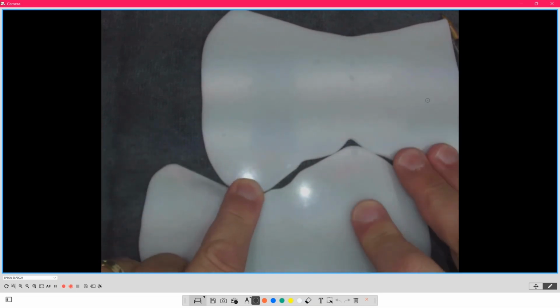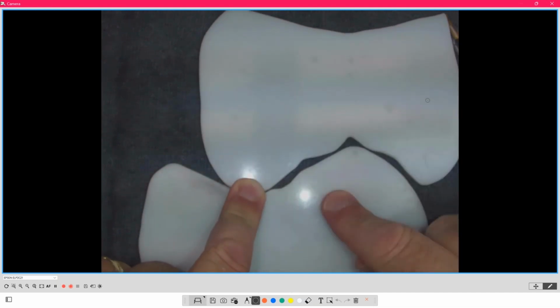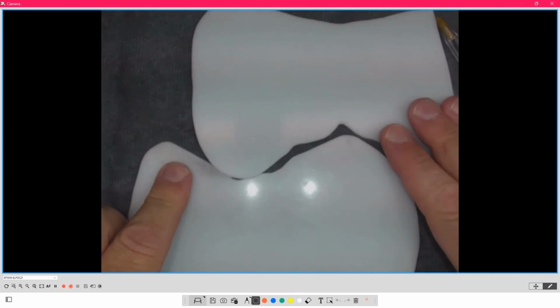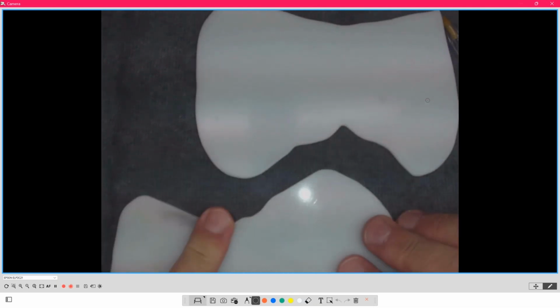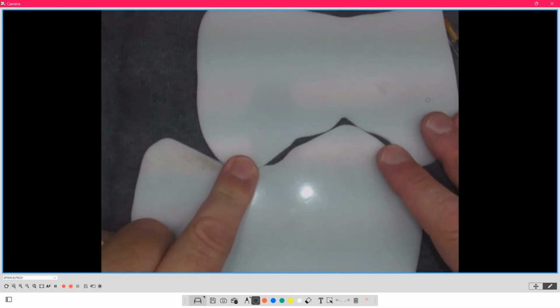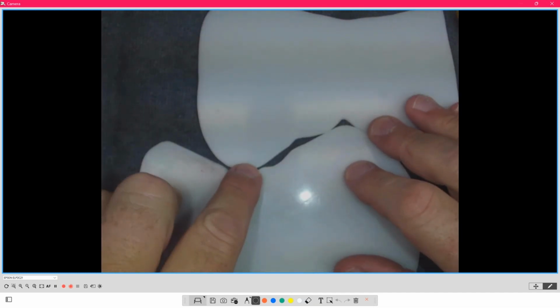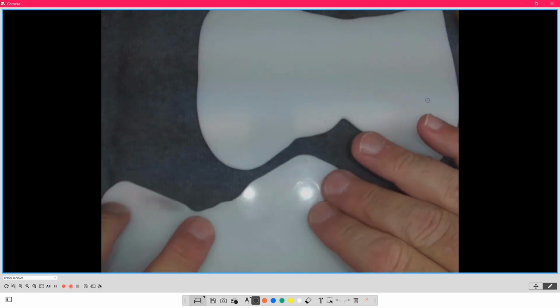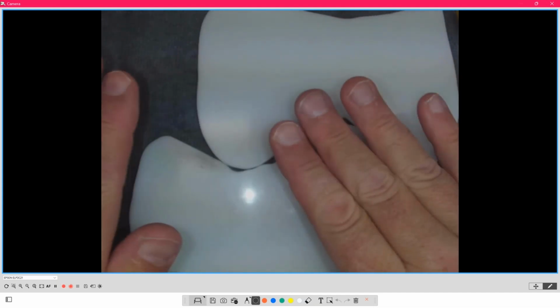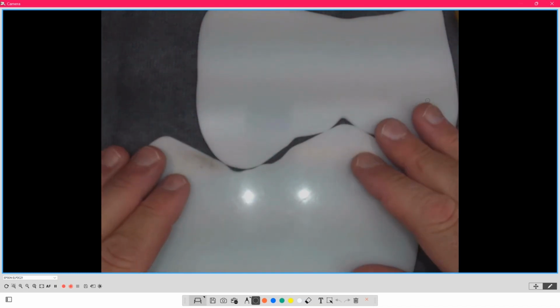When they build them, it's tight. There's no play in centric. So now you're asking a patient who cannot feel their denture teeth to accurately land in centric without hitting and sliding into position. That can't happen. And because the teeth themselves are so tightly knitted together, that I showed you in that PowerPoint picture, it has to touch and slide into position, and that's what rocks the plate and breaks things. And that's where we run into the problems.